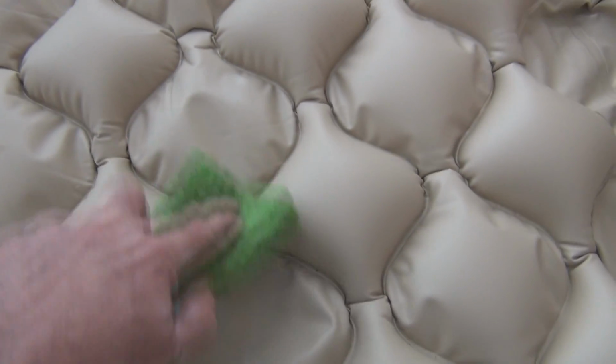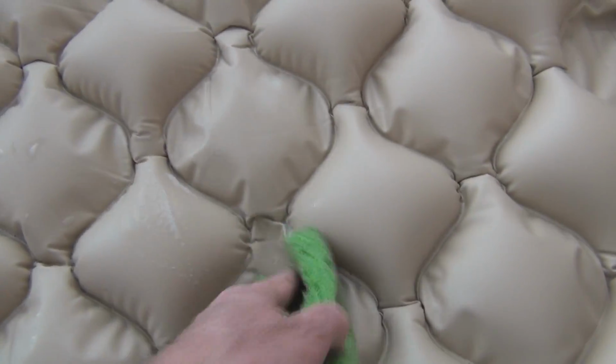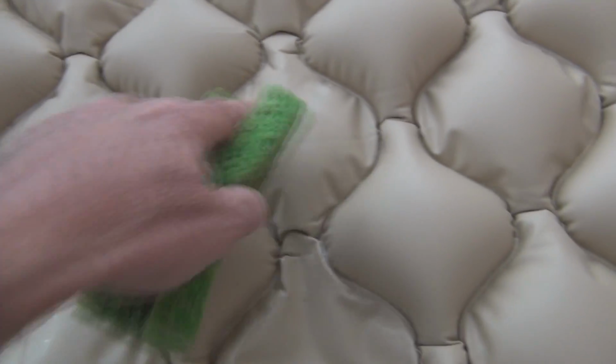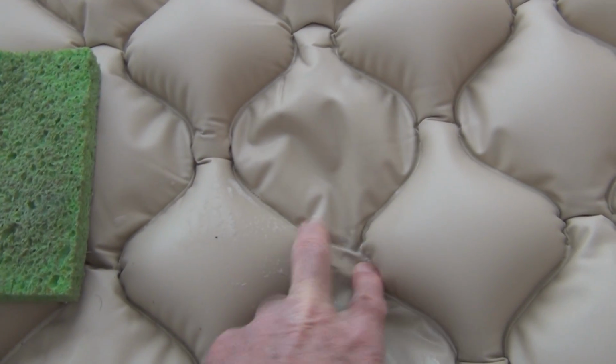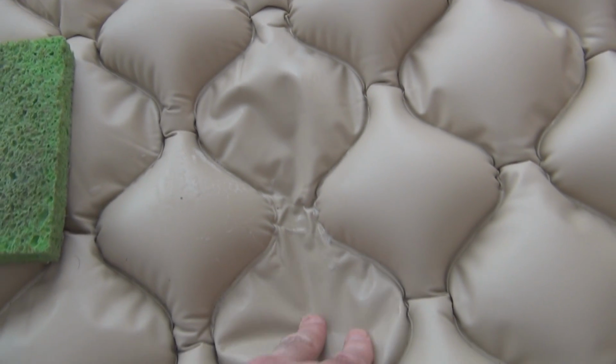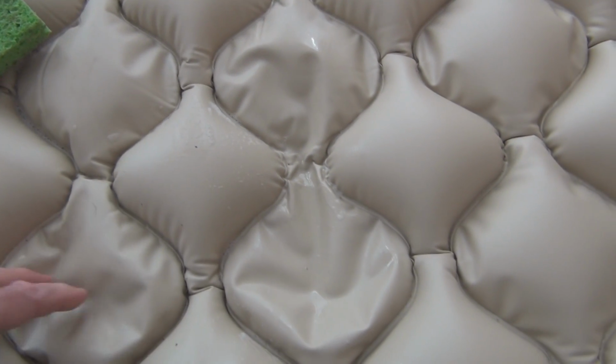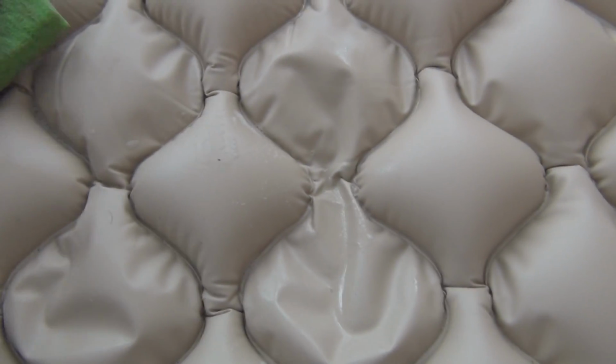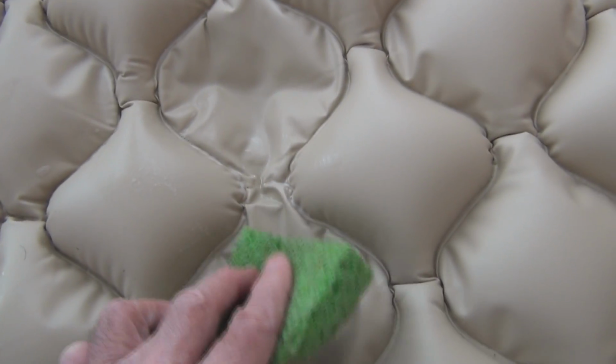So as soon as the guy mentioned the repair kit, it sort of jogged my memory, but I couldn't find it, and I'll probably find it when I'm not even looking for it. But he mentioned taking some soapy water, and this is alternating pressure, so the pressure's going up and down, so there's a lot of stress, a lot of wear going on, and it's eventually going to fail. So I did find the leak, but I don't have, if I can find it now.